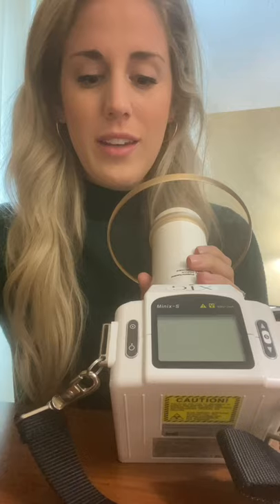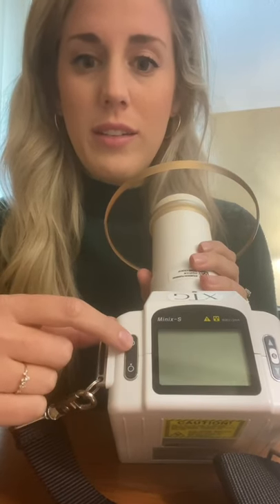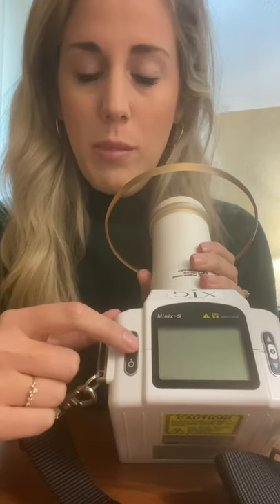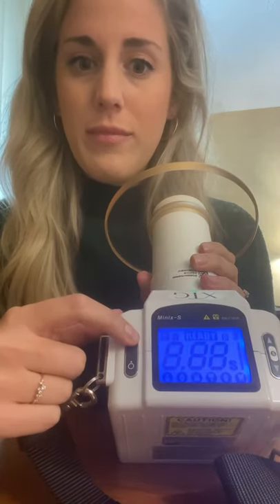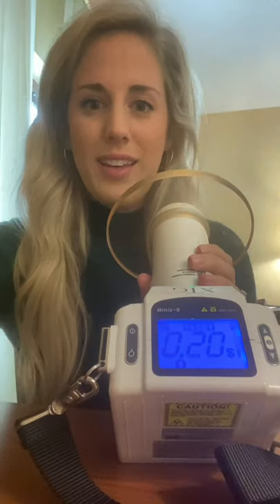Hey guys, it's Casey with DigiDoc and I'm just going to give you a quick rundown on how to use your XTG. This button right here with a little dot in the circle is your on button, and this is the off button. To turn it on you do have to hold it for a couple seconds — it's not going to turn on if you just tap it, but if you hold it for just a couple seconds it'll turn on.